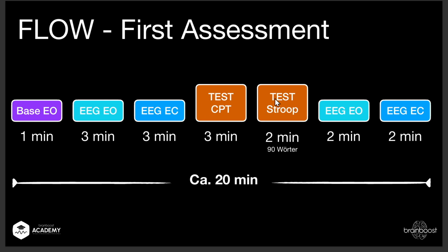And then we have 2 stressors. We have different tests, up to 5 tests in our BrainAssistant. It's also available for everybody. I explained this in a different webinar.